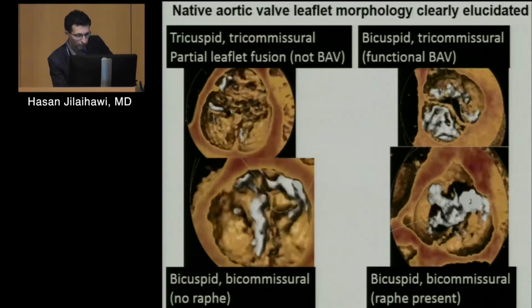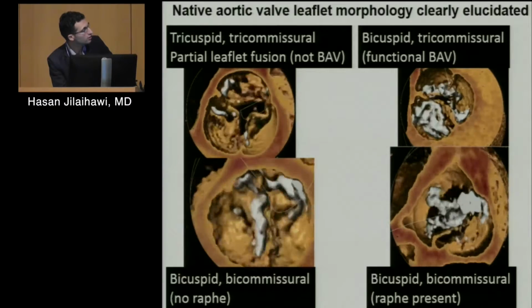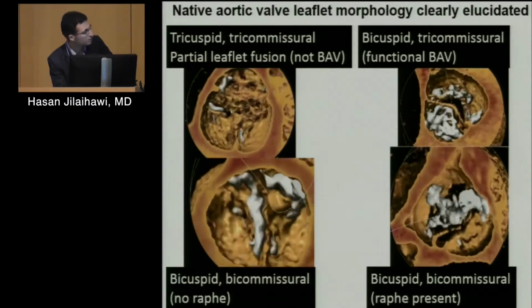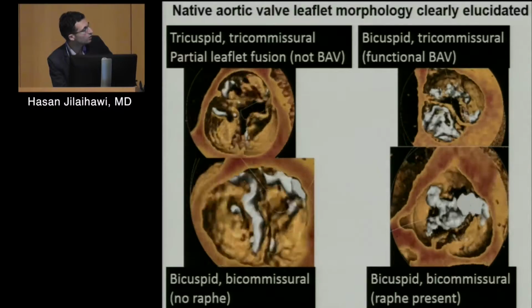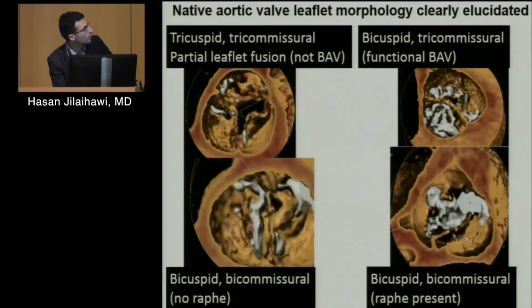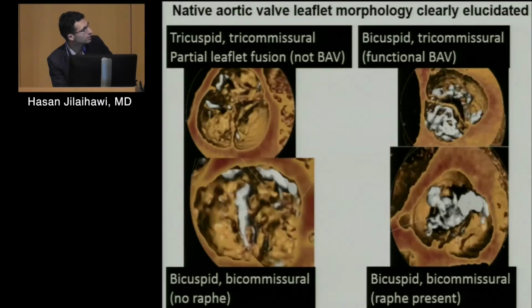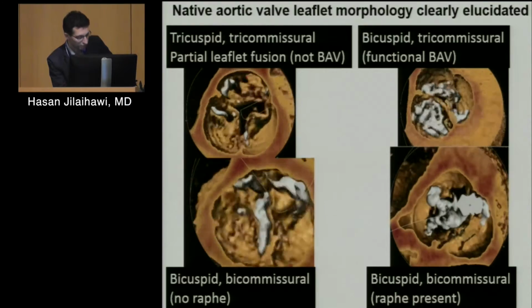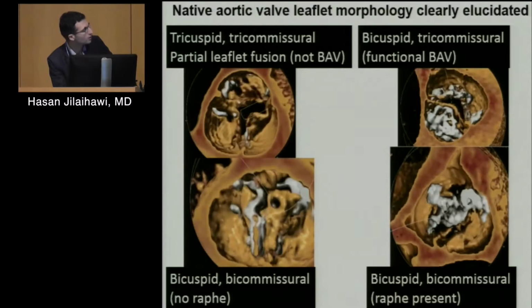So we're very, very much turned to the CT where we have these gray zone cases with intermediate gradients, because we get a very tactile feel of a very, very visual assessment, very clearly assessing the degree of stenosis, at least anatomic stenosis.